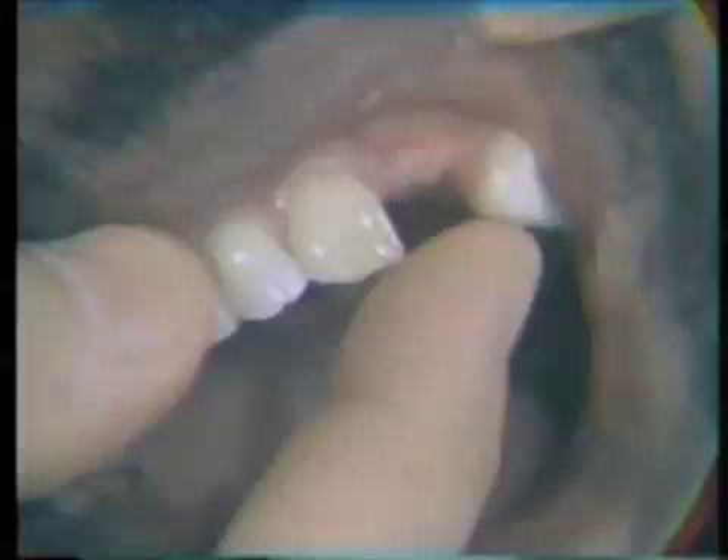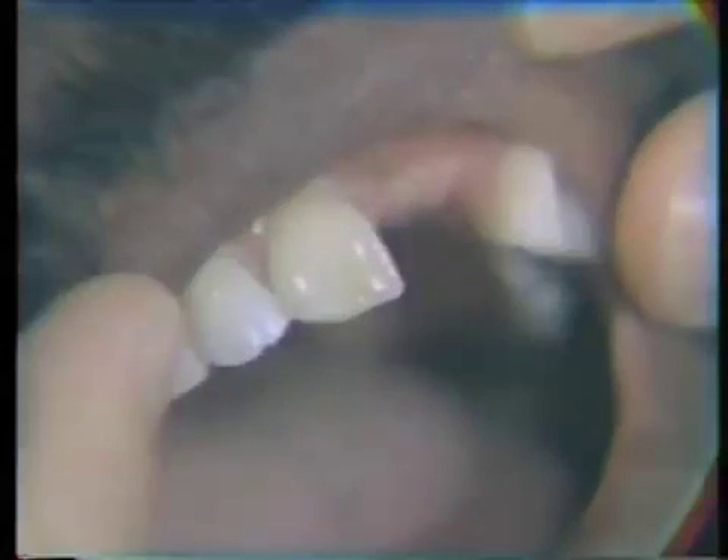We're going to prepare a direct gold core for the central incisor. The patient had lost the central and lateral incisor in a football injury, and the remaining central incisor is devital. The tooth has changed color and has darkened considerably, so in order to make an aesthetic anterior bridge, we are going to do full coverage on this central incisor. Efforts to bleach this central incisor have been unsuccessful.